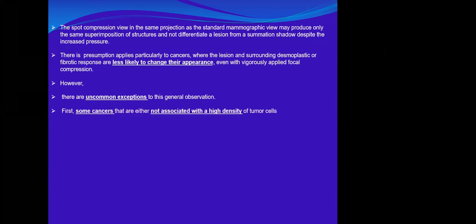The spot compression is more vigorous than the standard compression. It might not change. However, there are uncommon exceptions to these general observations. What are those exceptions?